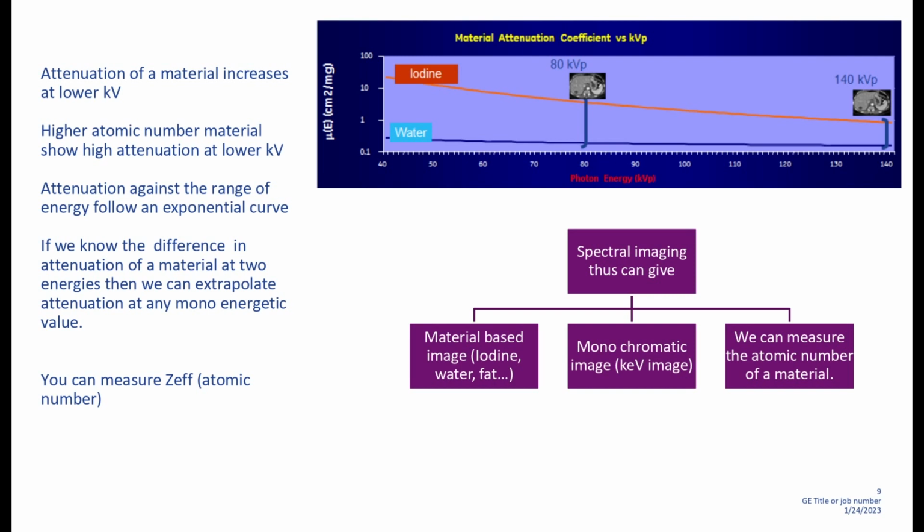That is where you get the peak attenuation. There is something called peak attenuation by that material, and we call that optimal CNR, optimal contrast noise ratio. Optimal contrast noise ratio will have a peak. That peak, by default most of the time, is around 65 to 68 keV for soft tissue enhancement, for example liver lesions, HCCs. So you should measure that value. I will show you how to do that also.